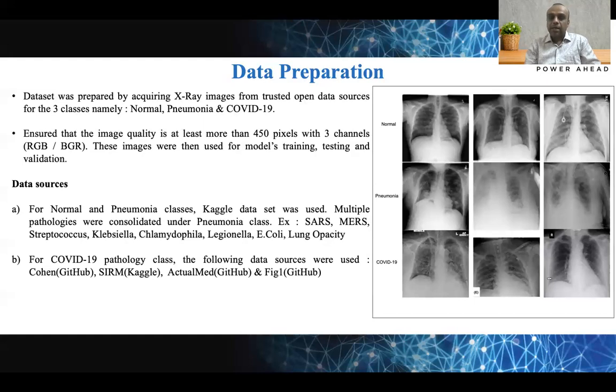As a layman, through the naked eye, it is very difficult to differentiate the different pathologies in X-rays. Only an expert radiologist could tell us what is going on here and what the exact pathology is. So in this paper, we are attempting to see if our transfer learning methods in deep learning can help us in accurately finding the pathology.